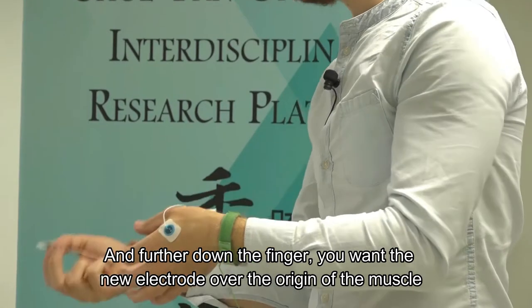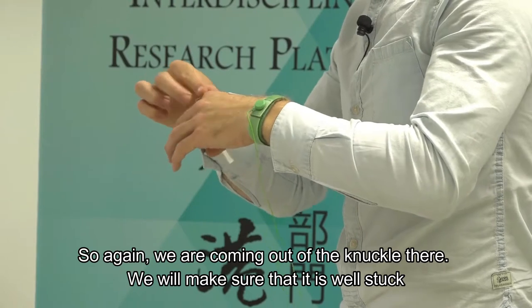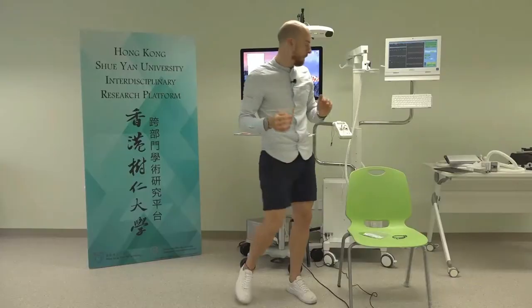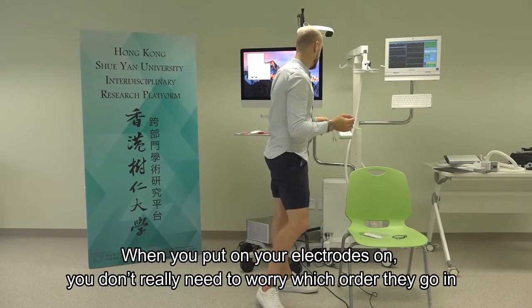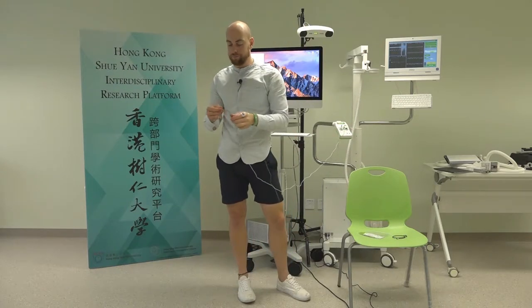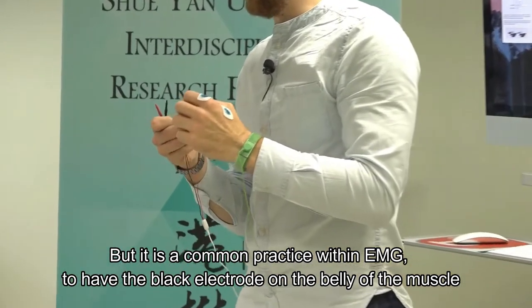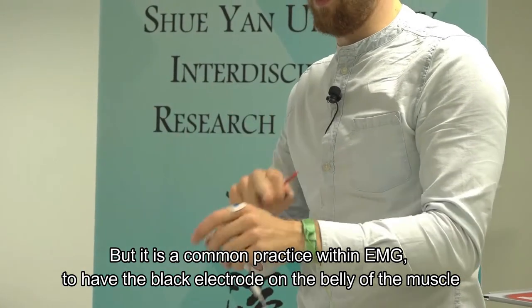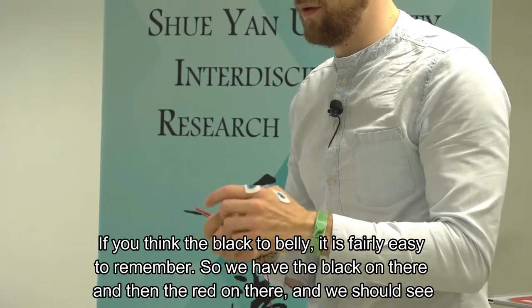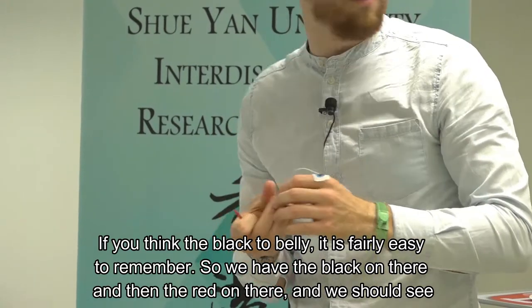Further down the finger, you want the other electrode over the origin of the muscle, coming out of the knuckle. It's common practice in EMG to have the black electrode on the belly of the muscle - think 'black to belly', it's fairly easy to remember. So the black goes on the belly and the red on the origin.